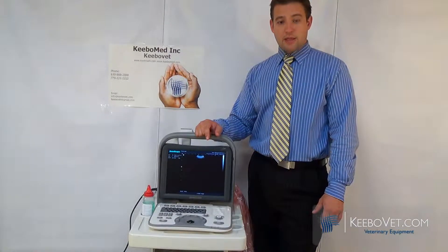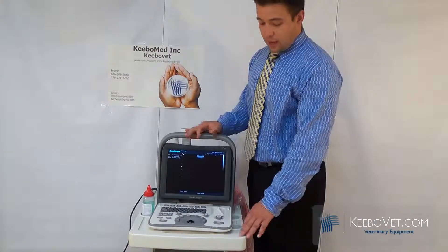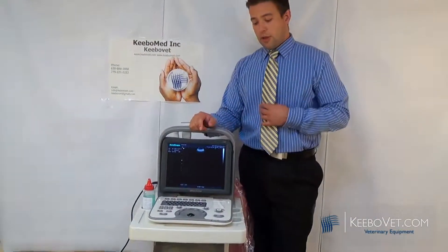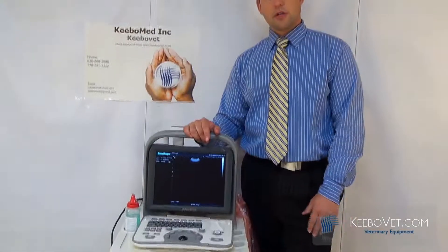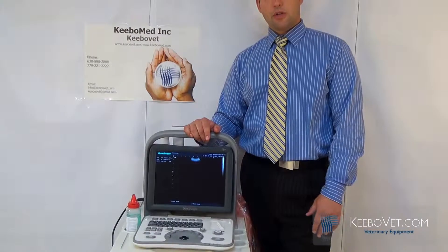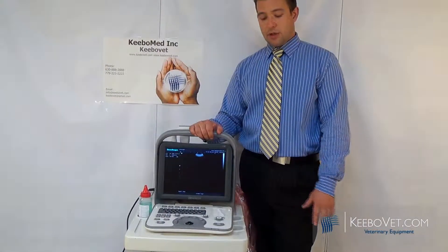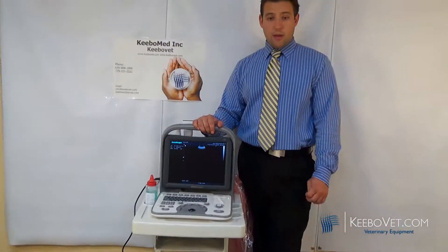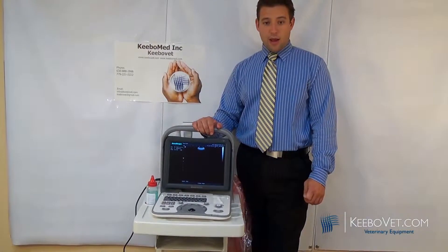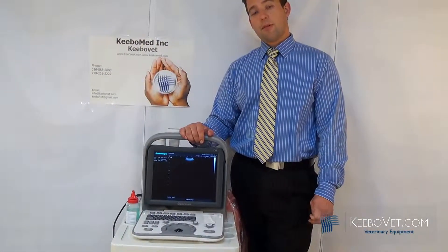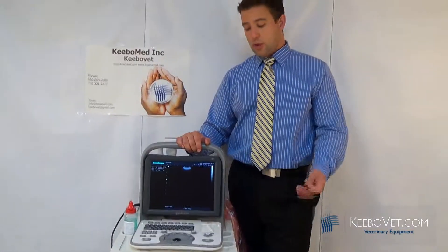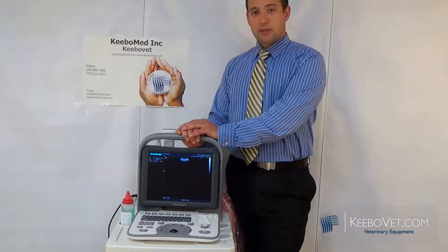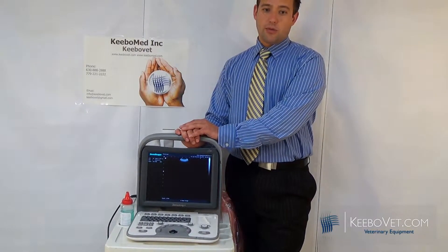Another great functionality feature is one-touch updates. When new software comes out or you want to change packages, you can easily update with a single click. You can also select different parameters — for example, if you're doing OB packages or calculations, you can choose which settings and calculations you prefer to use.